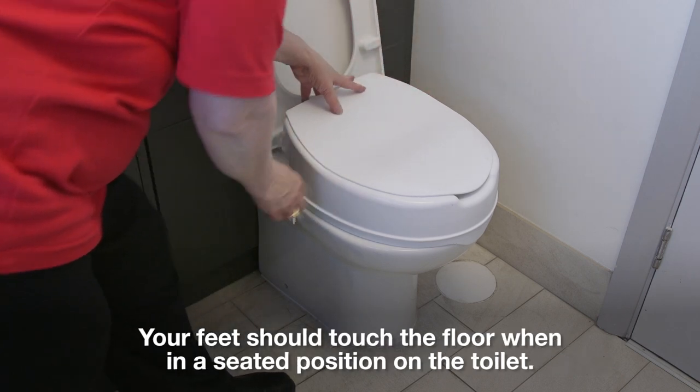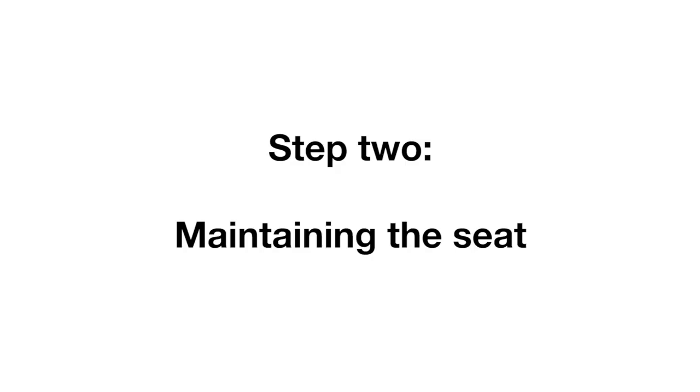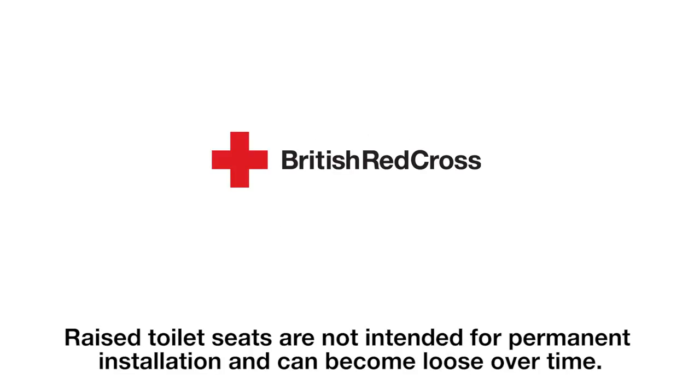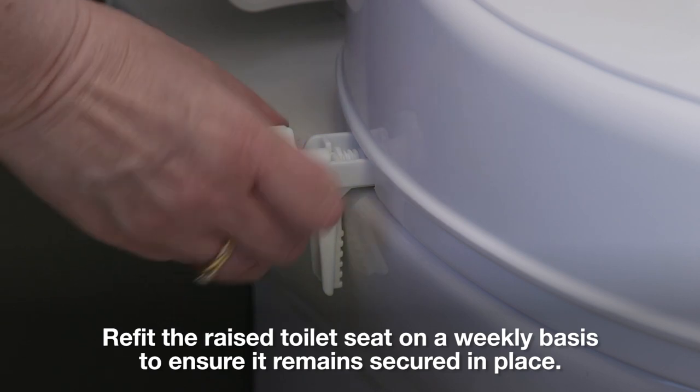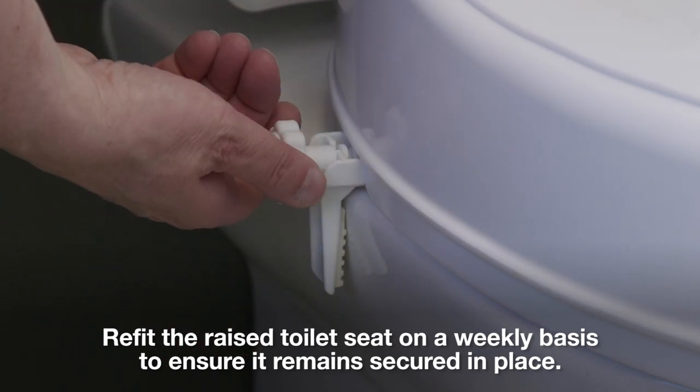Your feet should touch the floor when in a seated position on the toilet. Step 2 – Maintaining the seat. Raised toilet seats are not intended for permanent installation and can become loose over time. Refit the raised toilet seat on a weekly basis to ensure it remains secured in place.